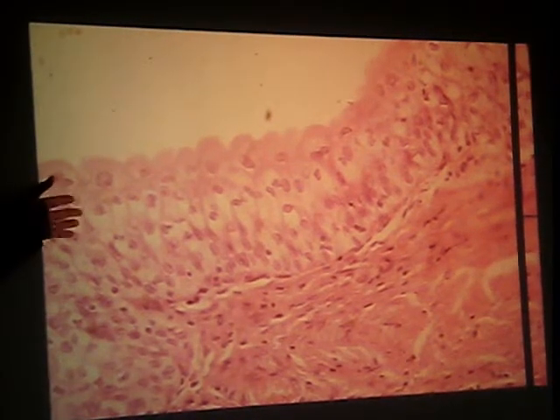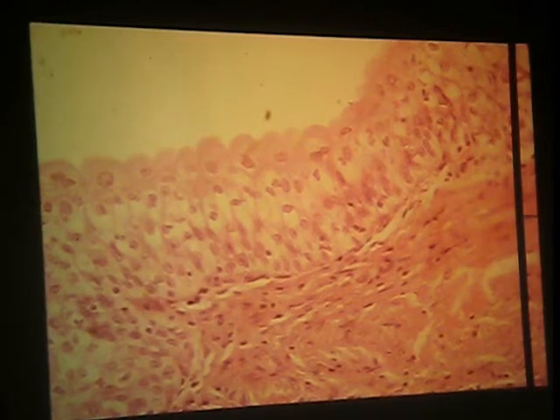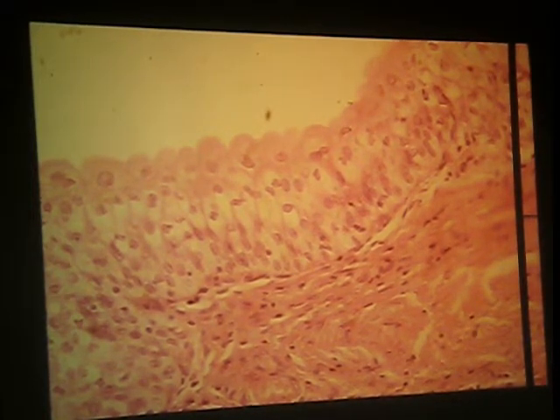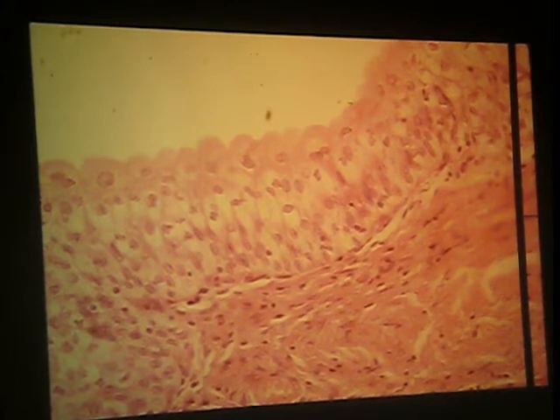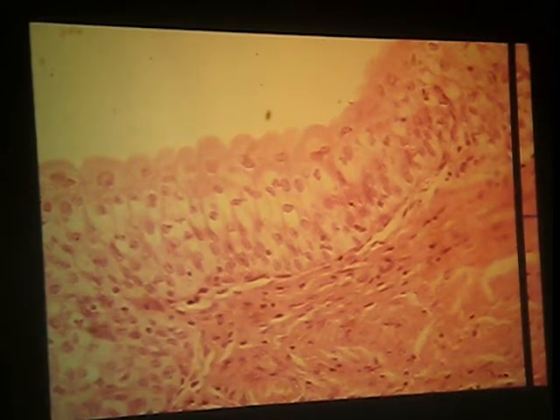What kind of epithelium? And realize that transitional epithelium runs from the minor calyx all the way to the proximal portion of the urethra, including the ureter and the bladder. How are you going to tell the difference between ureter and bladder? Lots more muscle in the bladder wall than in the ureter wall. Same kind of epithelium. It's just one of those kind of obvious sorts of things.